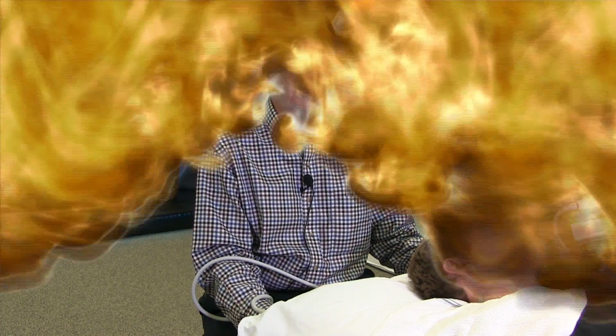I'd like to give you a hot tip for the day, something that I've learned over the years of carotid imaging to improve the carotid image, particularly on the internal carotid.